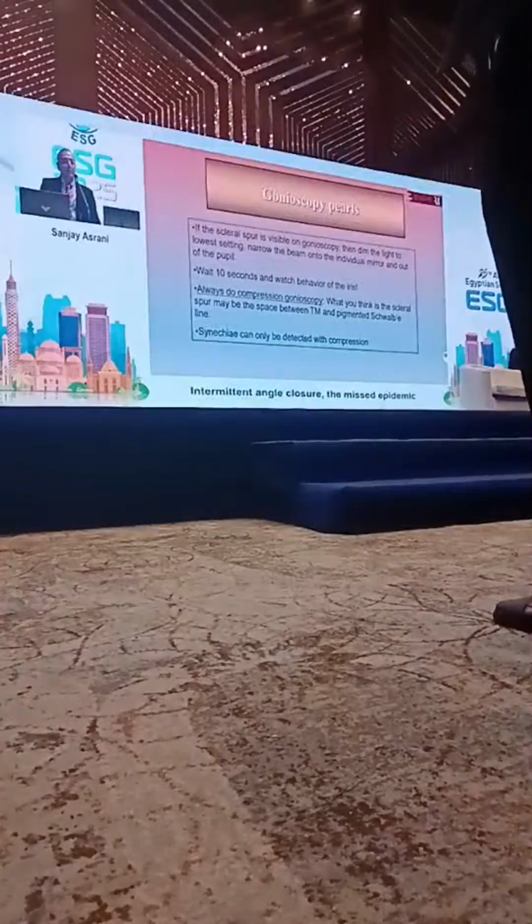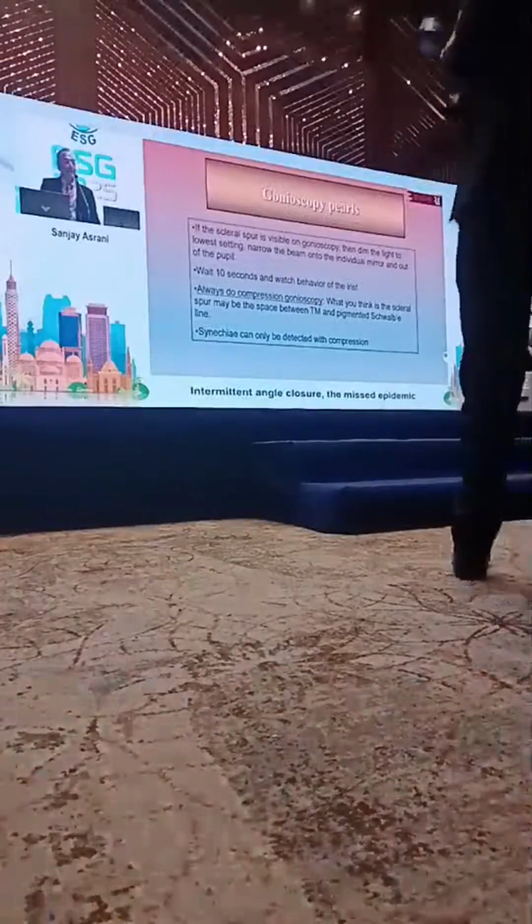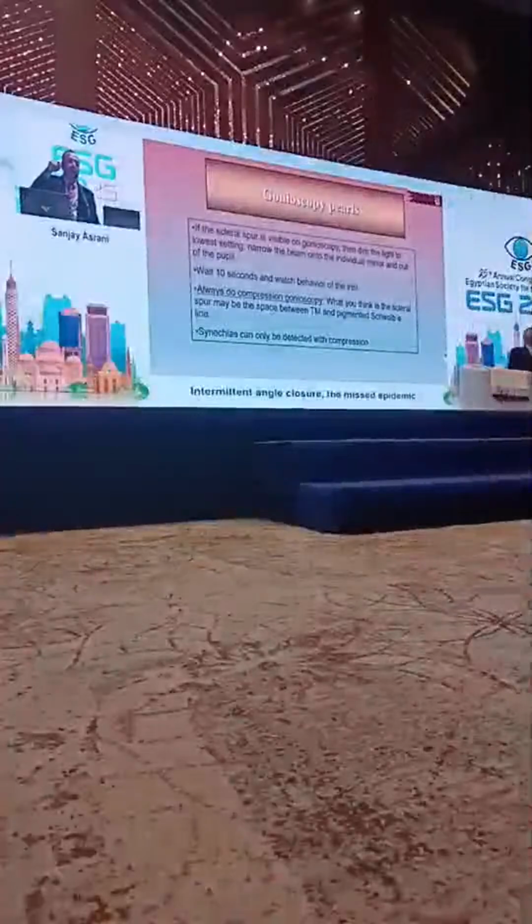But the critical thing that I'm going to leave you with is 10 seconds. Just remember this. Once you put the gonio lens on the eye, the pupil constricts, and the angle opens.